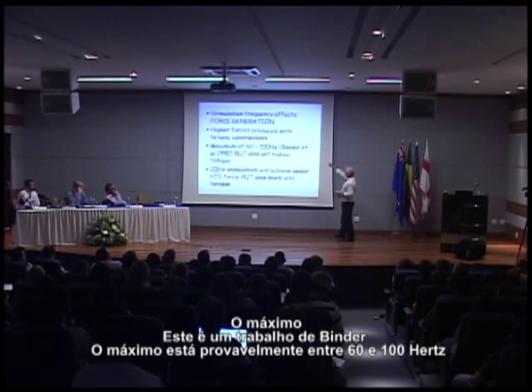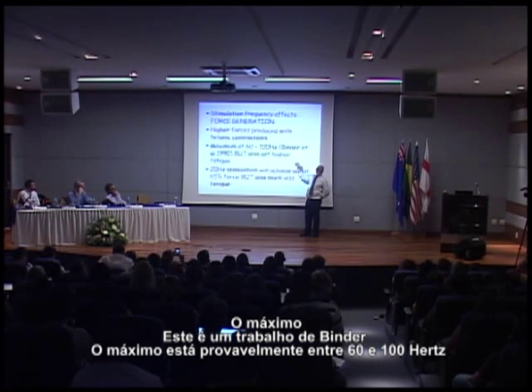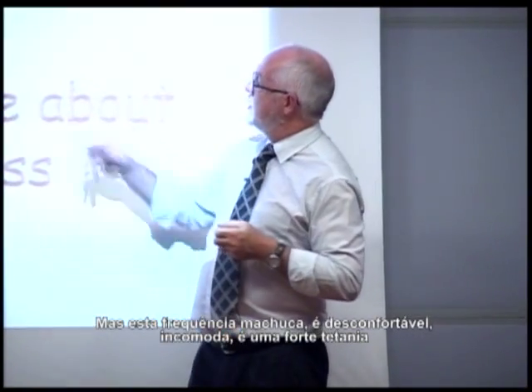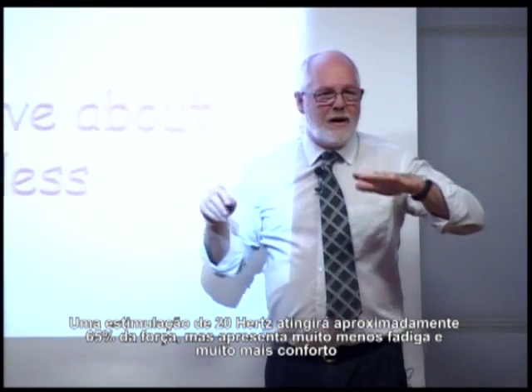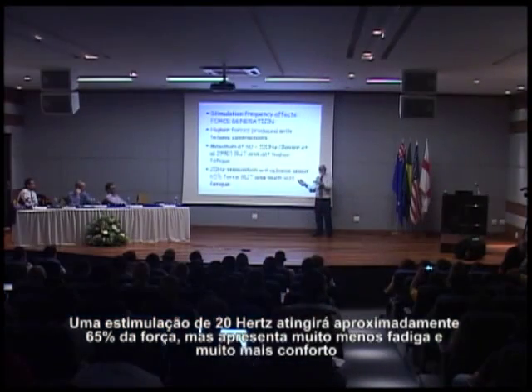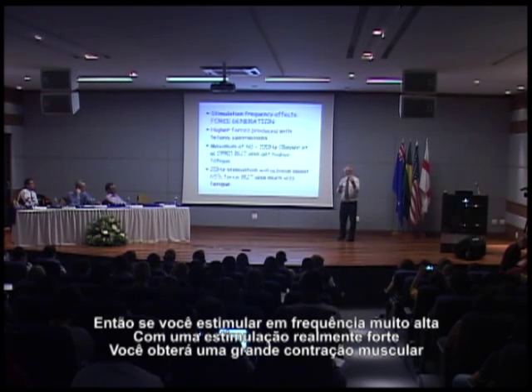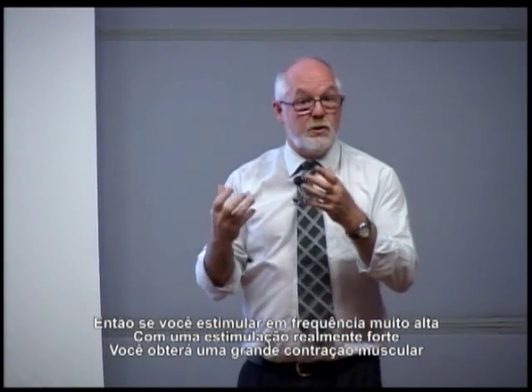Your maximum, and this is some work way back by Binder, is probably around 60 to 100 hertz, but that's uncomfortable, that hurts, that's unpleasant, that's a strong tetany. 20 hertz stimulation will achieve about 65% of the force, but it's a lot less fatigue and a lot more comfortable. So if you stimulate at really high frequency with really strong stimulation, you will get a big muscle contraction.